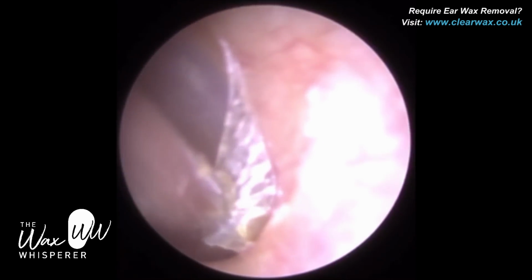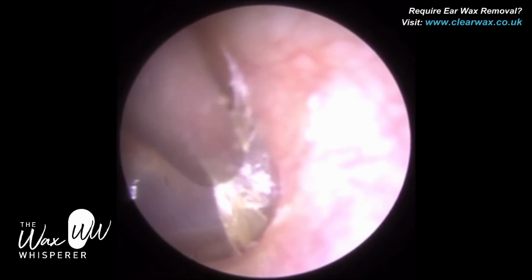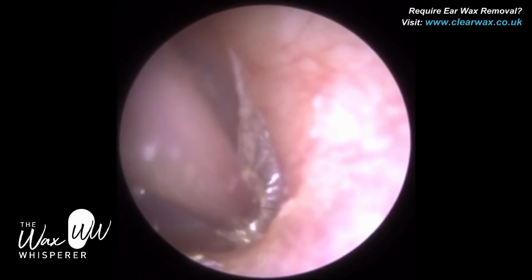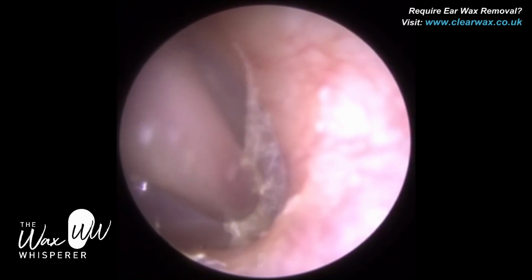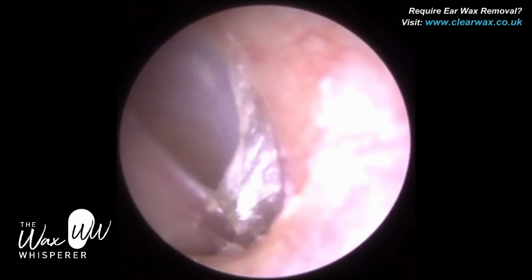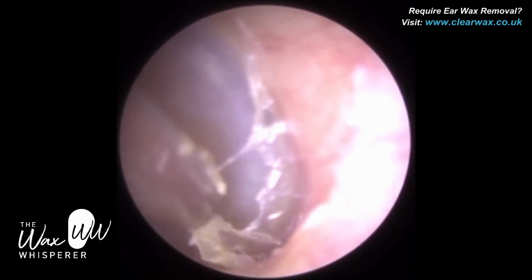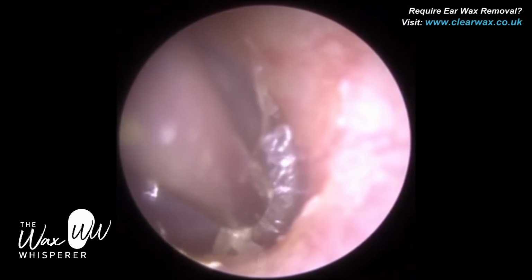But the advantage of the endoscope is the field of view. It's just incomparable. Not only am I peeling this dead skin off the canal wall, I'm really near the eardrum here, but I'm also able to see the ear canal, so I can navigate the fine end. I can think, okay, well, I'm peeling it here, I want to peel it off here as well. It gives me more manoeuvrability, more agility, the endoscope.